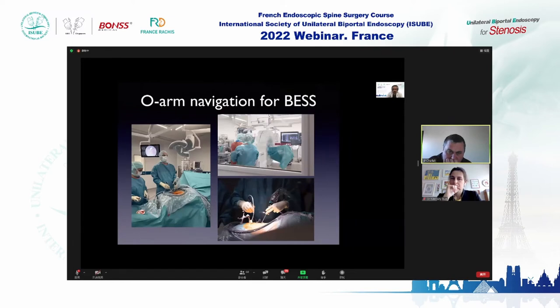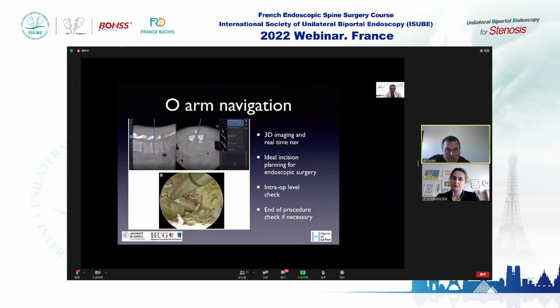Here is the setup at Hôpital Latour. The O-arm is in place; we do the three-dimensional reconstruction and then navigate in real-time. You can see the reference frame inserted in the iliac crest of the patient during a biportal endoscopic disc herniation surgery. The O-arm navigation in endoscopic surgery is an advantage — it allows 3D imaging, real-time navigation, incision planning, intraoperative localization, and end-of-procedure implant checks.